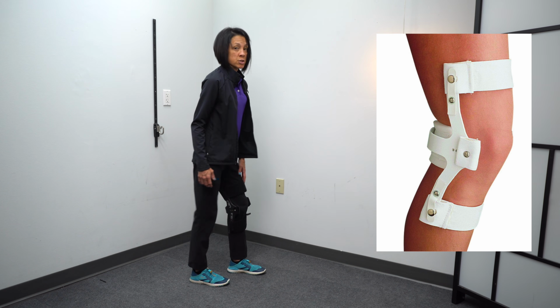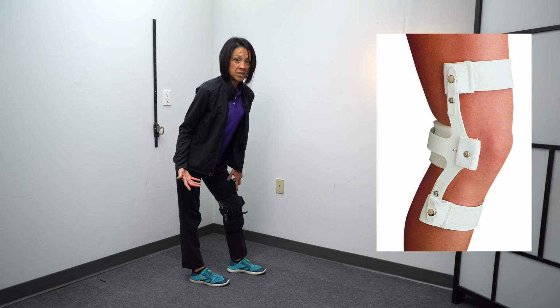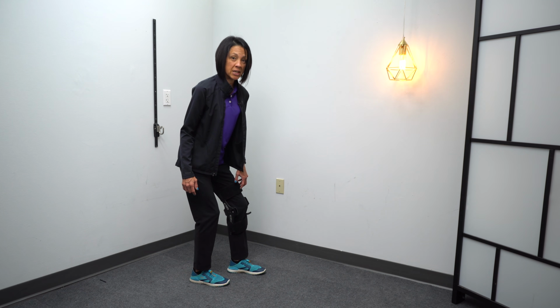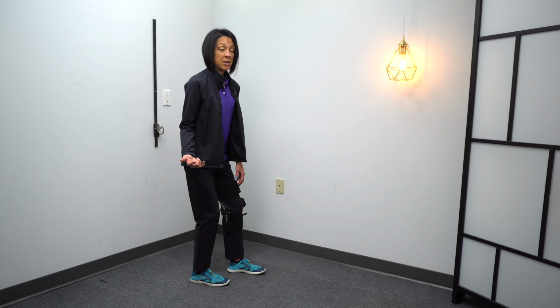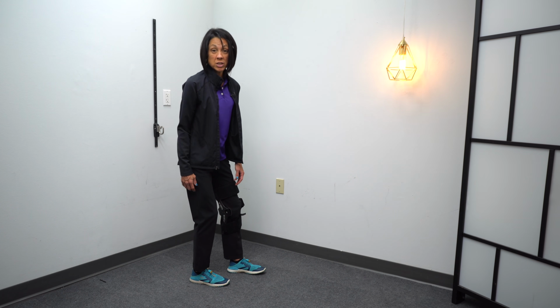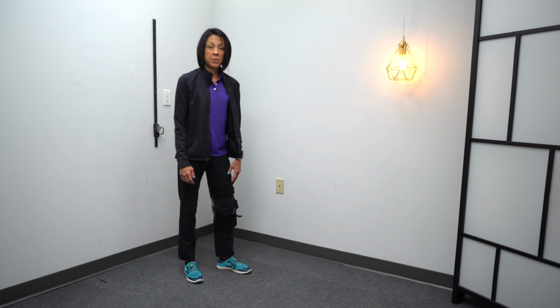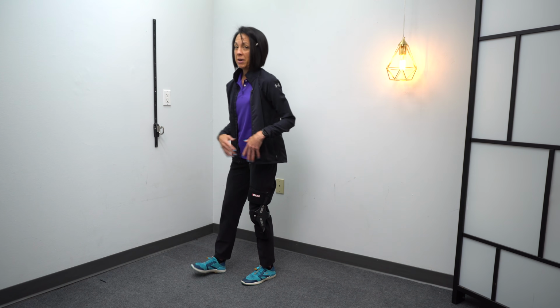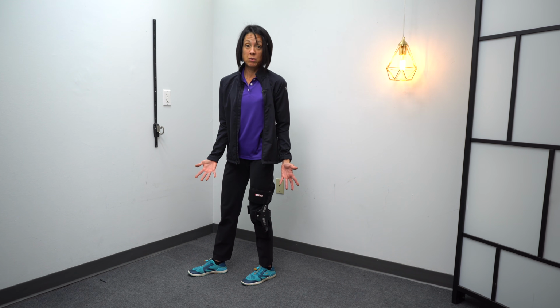Let me show you on this side. If I'm hyperextended, or if my foot's pointed, that could potentially lead to knee hyperextension. When I bend my knee, look what happens to my ankle. It dorsiflexes. It flexes, right? So if you're someone who absolutely cannot dorsiflex your ankle, can you get around that and not let the foot dorsiflex? Yeah, you just keep your weight back. And I've definitely seen that in some people, that they have a tendency to do that. However, if all you have to think about is getting your weight over the foot, you let the brace do the rest of the work.